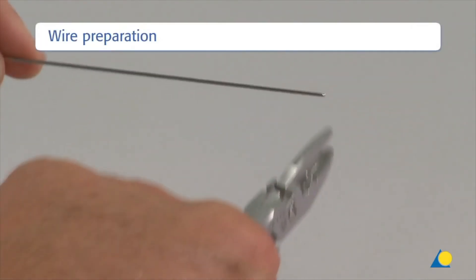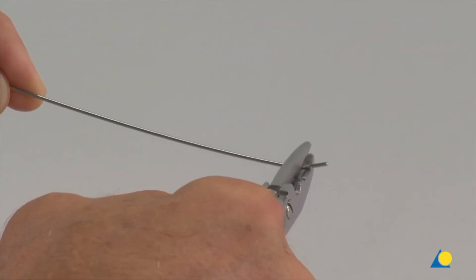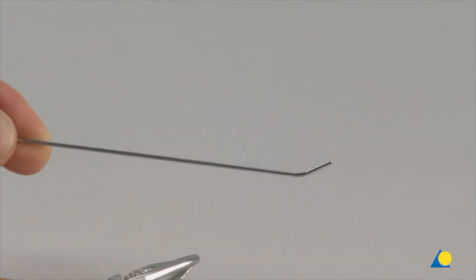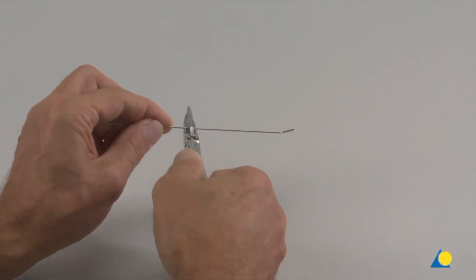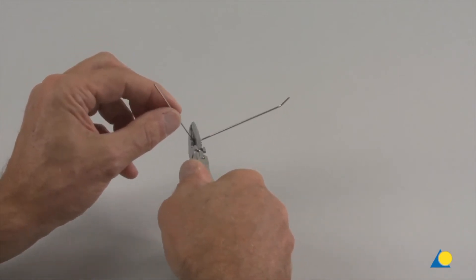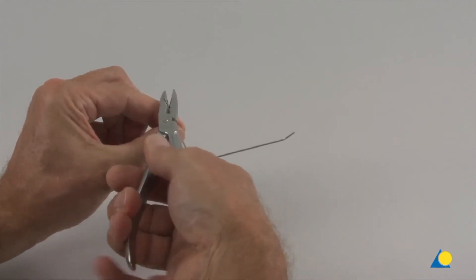Two 1.5 mm K-wires are bent with the wire bending pliers. The blunt end of the K-wire is bent to an angle of 30 degrees, about 15 mm from the end. At the other end of the wire, a right-angled bend is made in the same plane with the wire bending pliers. To prevent injury, the tip of the wire is turned in.